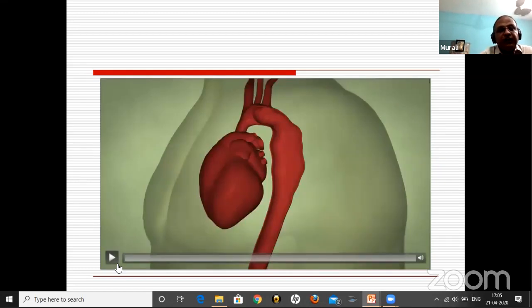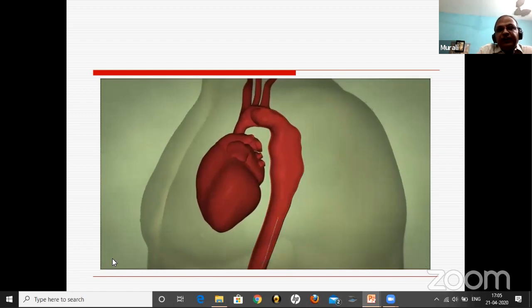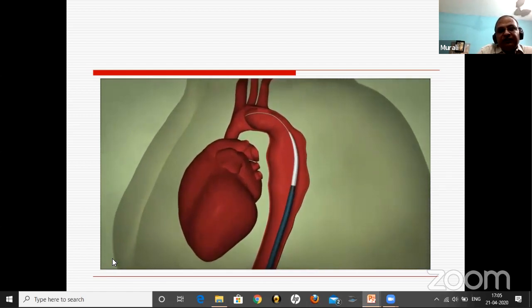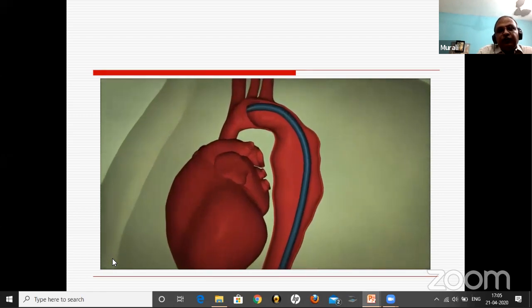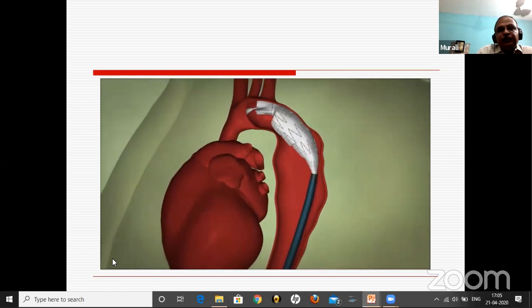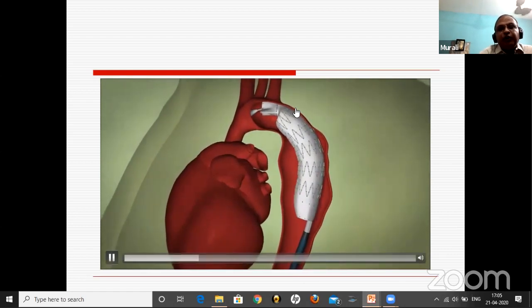So this is in thoracic. And when you do these techniques, you keep these injections, and always check that you have not covered these vessels. In the thoracic also, it is almost similar. You just deploy the same thing, and you deploy the top end at the end.